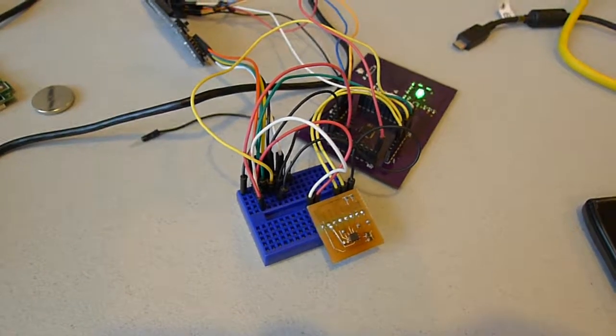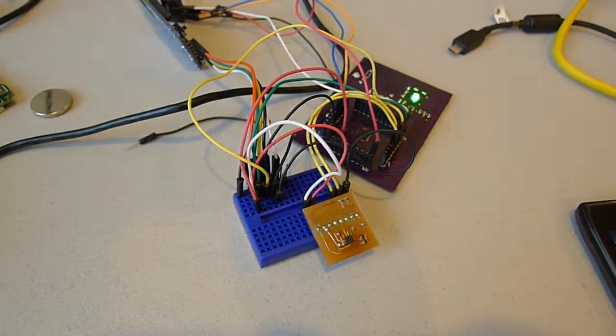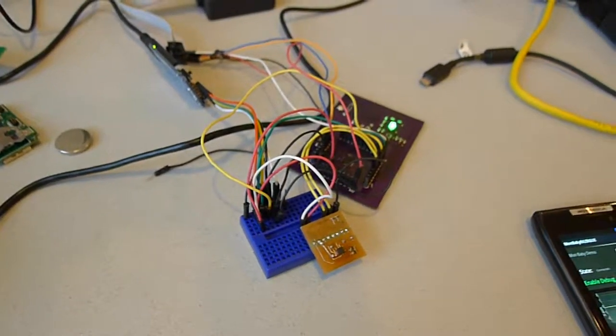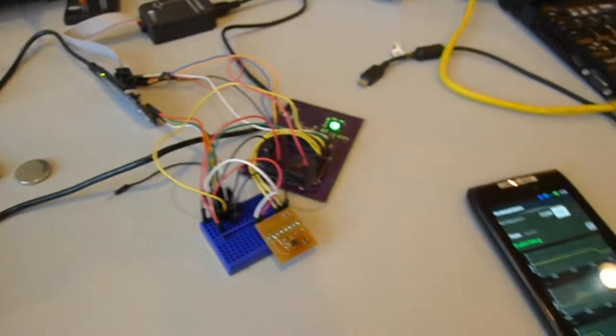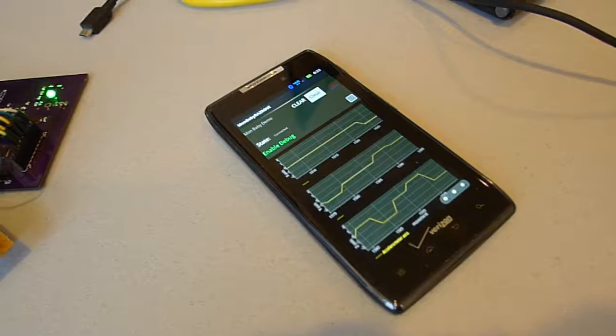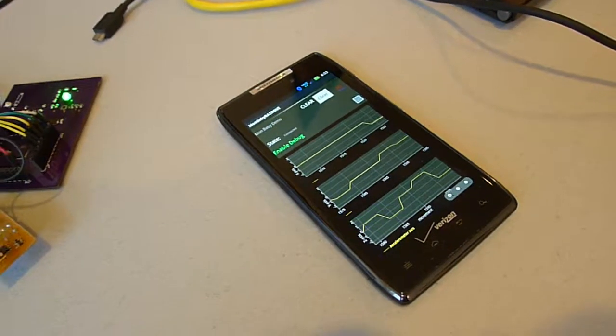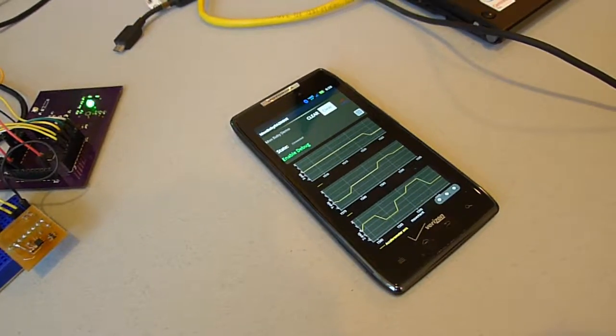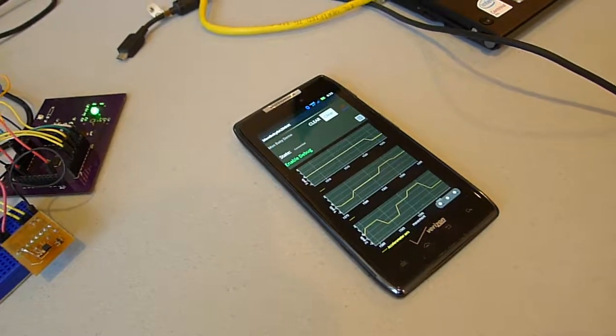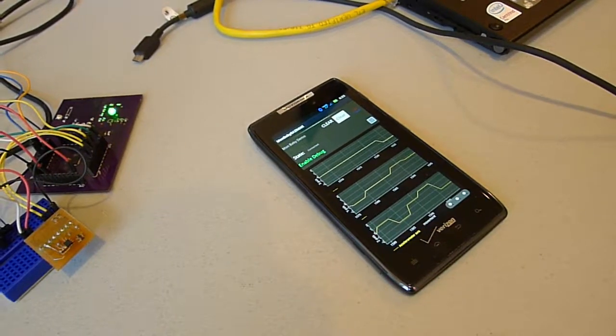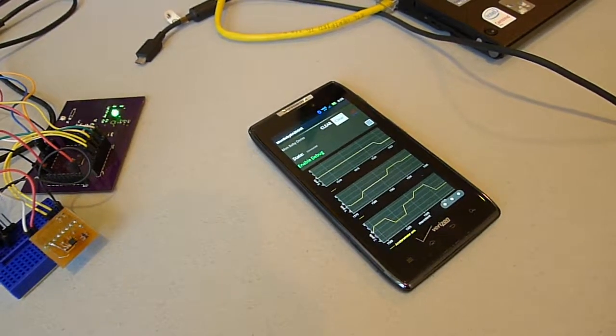Now, it takes values from the accelerometer, and then it shoots it wirelessly over Bluetooth Low Energy to an Android phone that's capable of communicating using Bluetooth version 4.0, which is BLE, Bluetooth Low Energy.